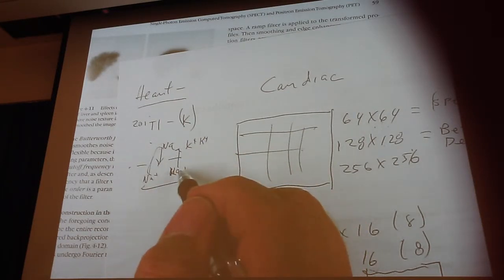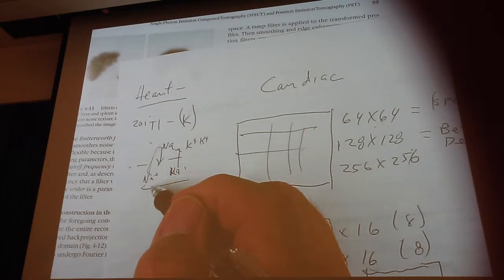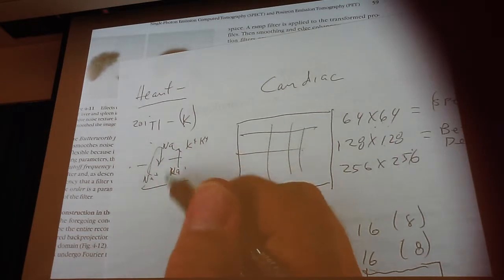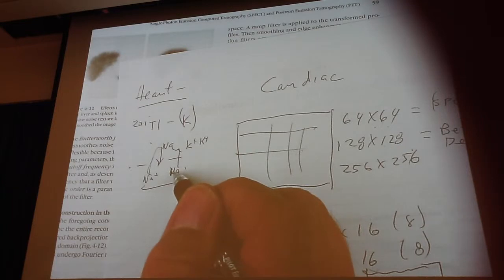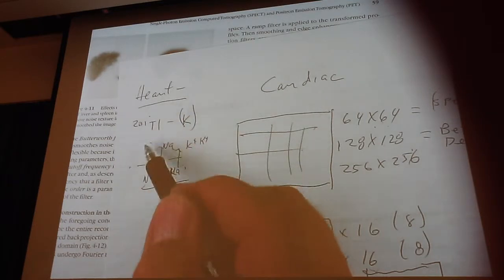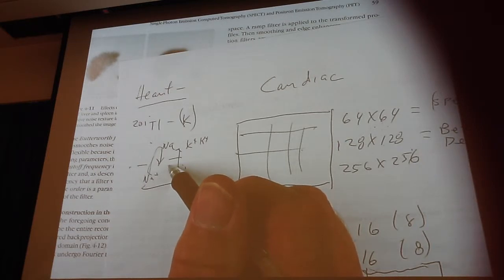But this stuff is going to stay in circulation. So it's not going to be staying in the muscle all the time. It's going to be creating a background that's going to be a problem for you. When we designed our computer program, we wanted to make sure that we removed the background created by potassium, and with sestamibi it's a different problem. So if you process the thallium images using the sestamibi protocol, you're going to be creating artifacts in your image.